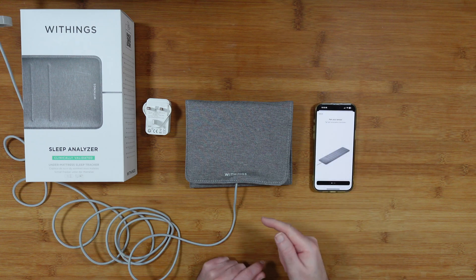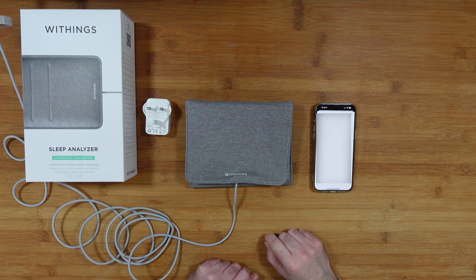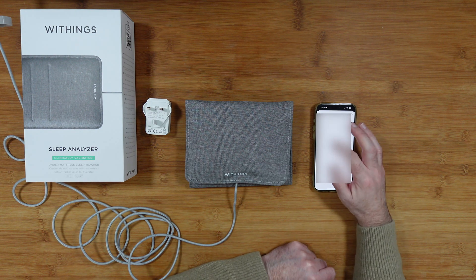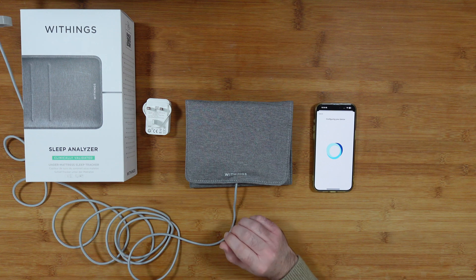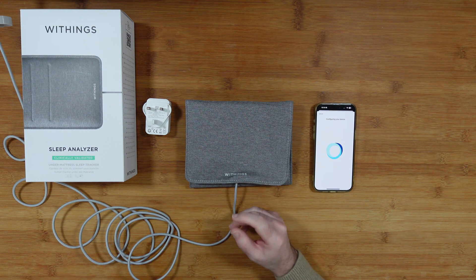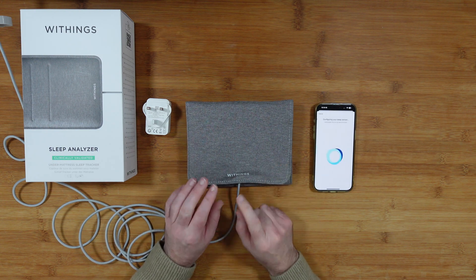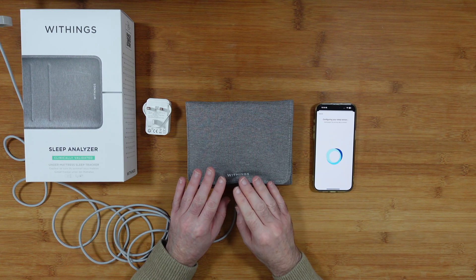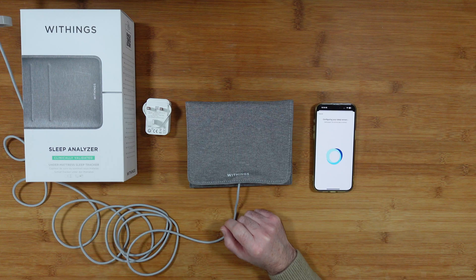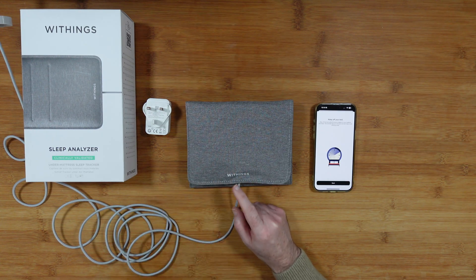Now we're going to pair. It's sending a request via Bluetooth — it says 'Connected.' It's now asking me to connect to a Wi-Fi network, so I'll blank that part of the video. It's now configuring the device. I connected it to my Wi-Fi very easily — took under 60 seconds. It's already checked for updates and it says 'Configuring — this will only take a moment.'